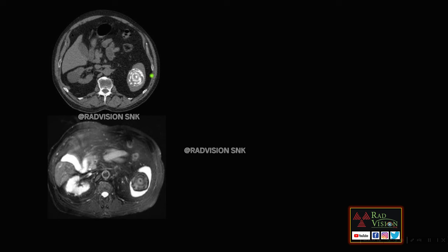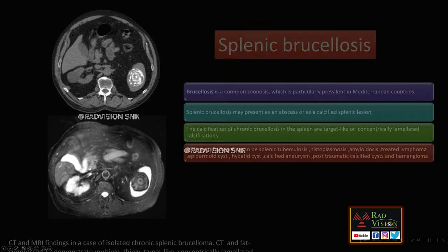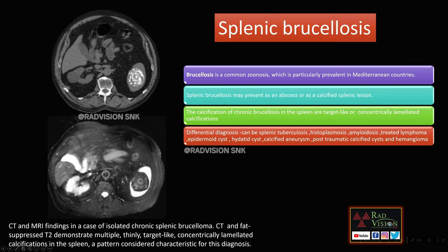Next case: here you can see there is a calcification noted in the spleen with a typical target-like or lamellated appearance, which resembles an onion-peel pattern. On this fat-suppressed sequence you can see this concentric lamellated appearance clearly. This was a case of classical splenic brucellosis.